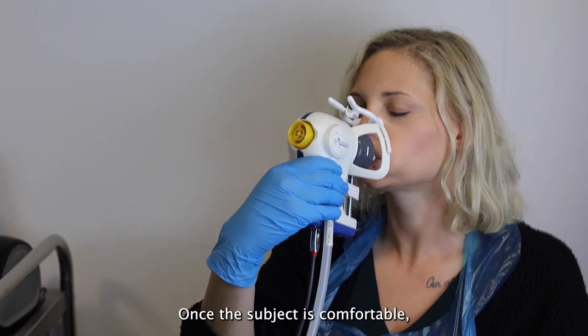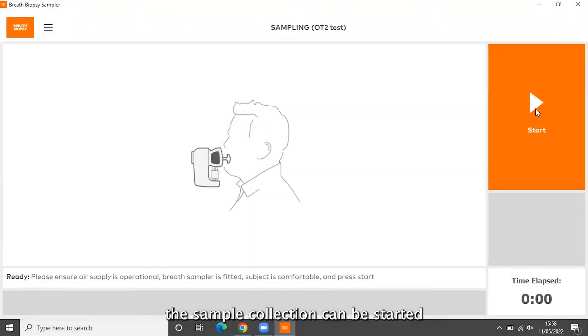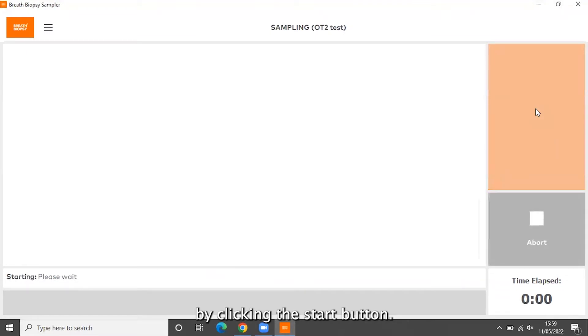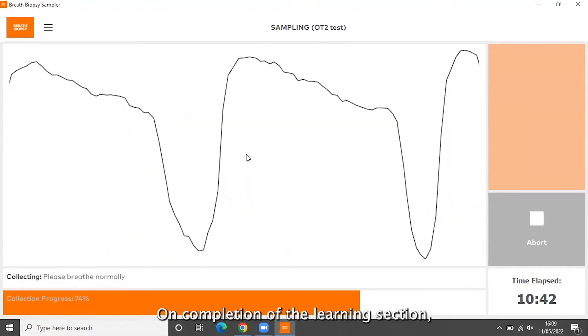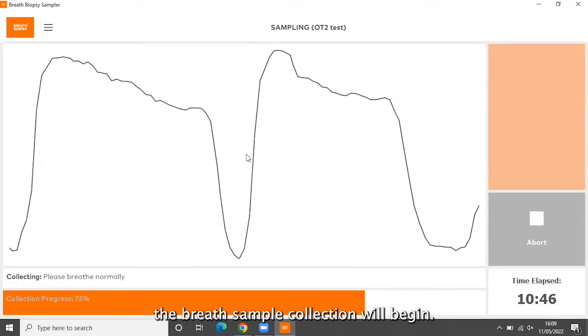Once the subject is comfortable, the sample collection can be started by clicking the start button. The software will then learn the subject's breathing pattern before starting the breath collection. On completion of the learning section, the breath sample collection will begin.